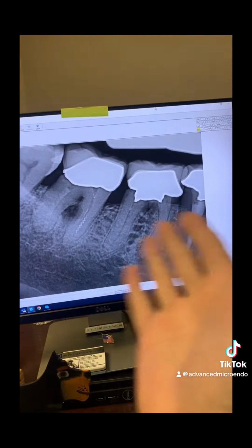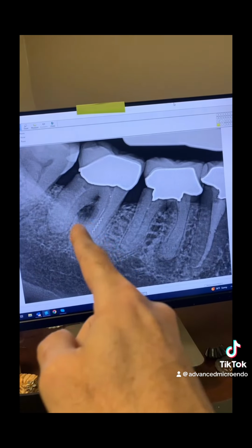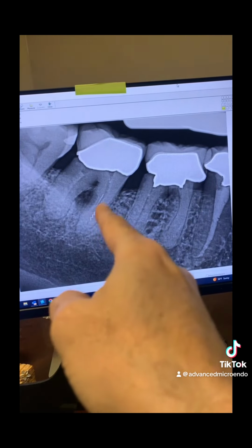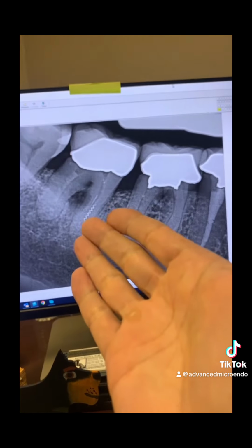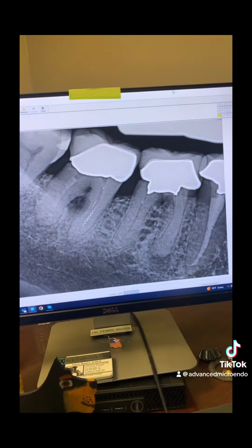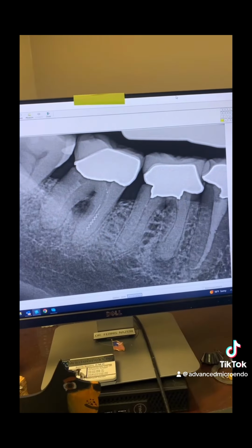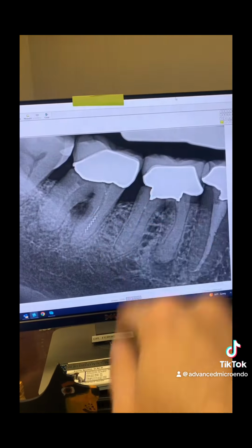So I went over her options with her. This looks like perio, with an 8-9 millimeter pocket. And what's going on with the endo? This tooth has a very poor prognosis. So the patient is welcome to go see a periodontist, but as I said, 8-9 millimeter pocket there, and furcation, not that much furcation, bone loss and broken files and lentula, all that stuff, Russian red obturation, very poor prognosis. So the patient decided to go ahead and extract this tooth.